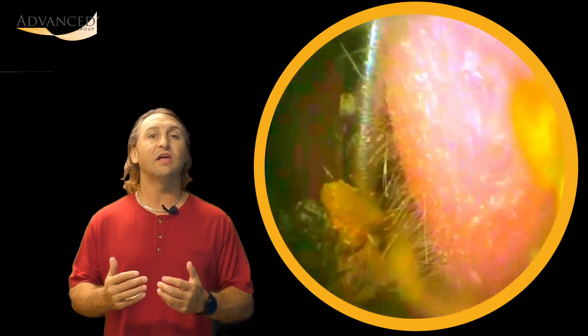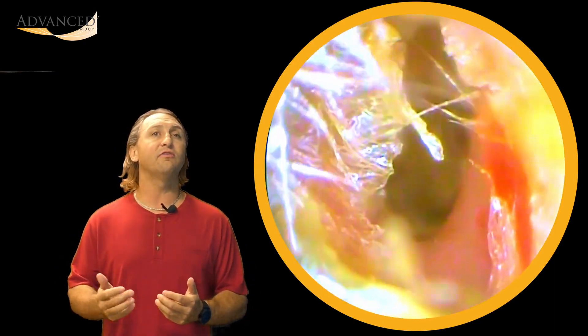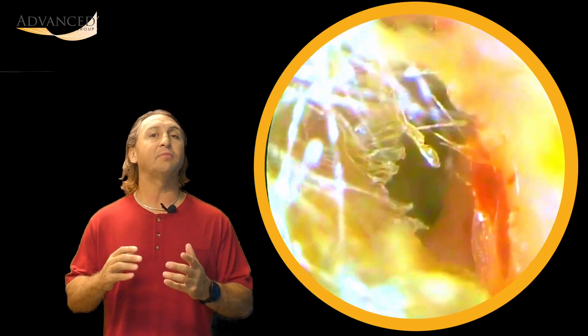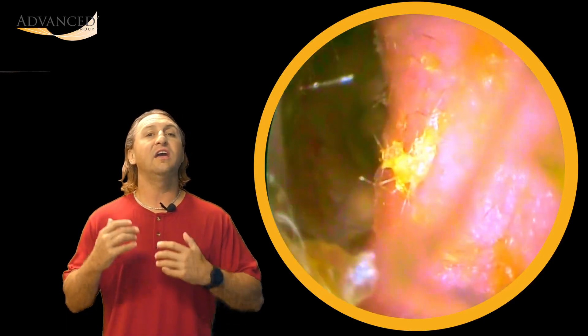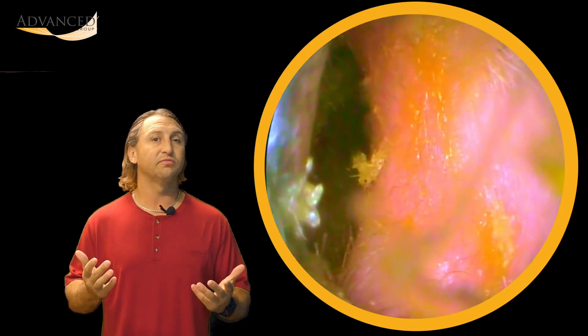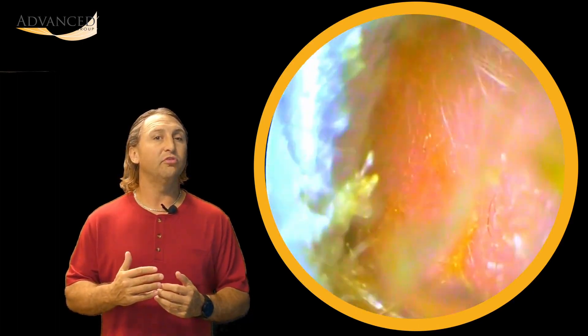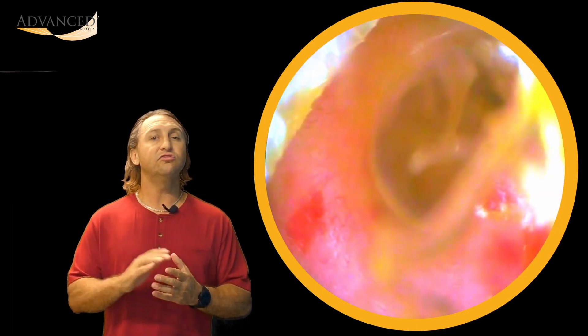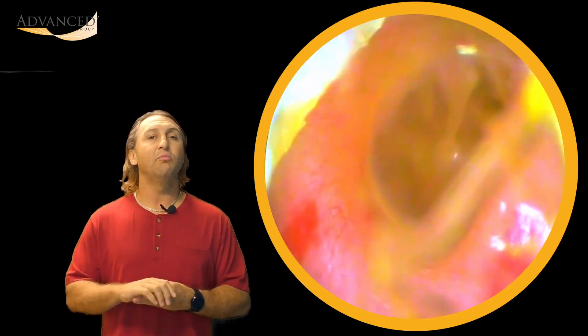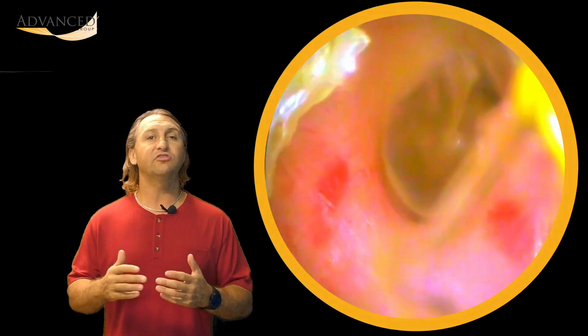That's not to say that collapsing canals directly cause ear infections. However, collapsing ear canals can absolutely hold water in the ears or other liquid in the ears, depending on what you got in there, and that can cause some infections or other problems with your ears. Again, here, as we're pulling this out, we're getting things that are stuck to the ear canal wall. So you do see a little bit of irritation there, but we now have a clear view to the eardrum and this patient has some relief from their hearing loss.